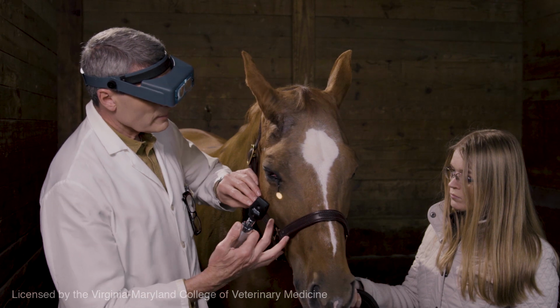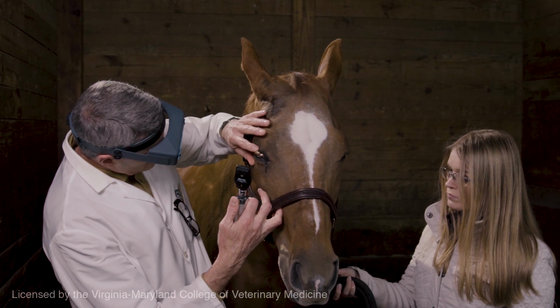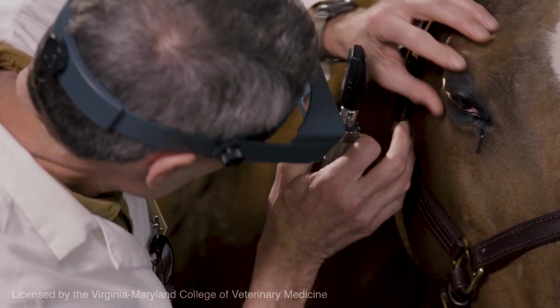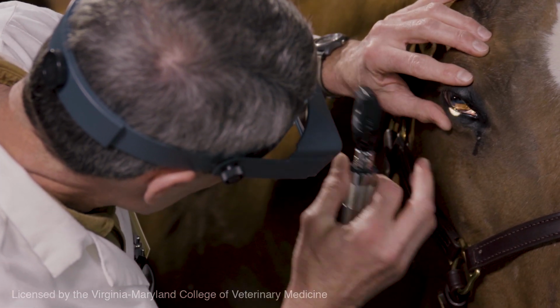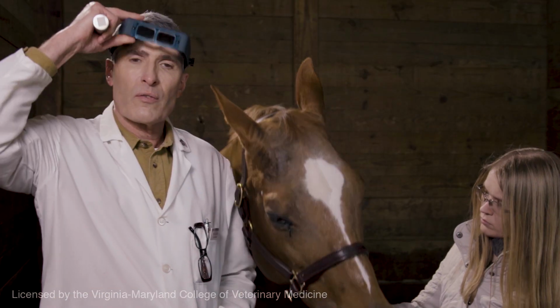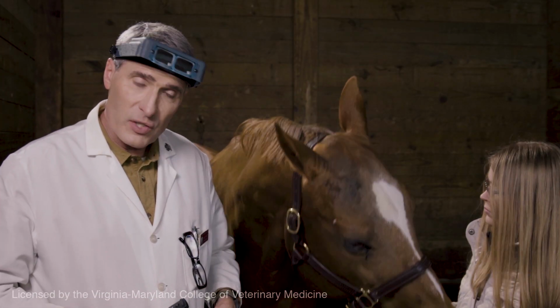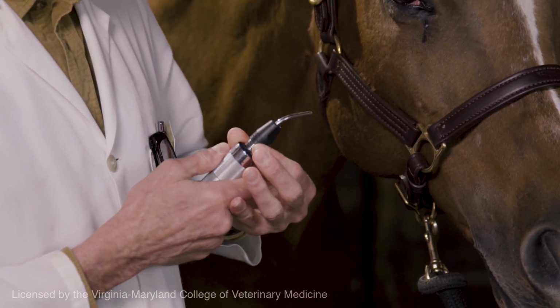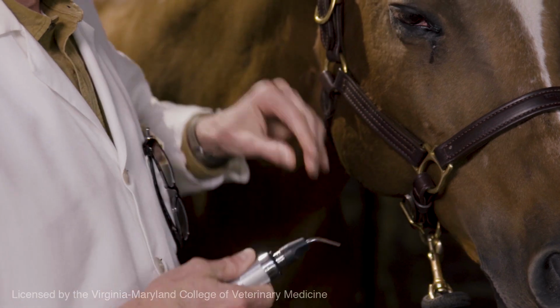And what we do is we're going to basically use this as our light source, and we're going to shine the light at different angles to what I'm looking at, just like we were using the slit lamp. So any light source would work for you with that very simple technique. You could use the Finoff transilluminator. We'd do the same thing.